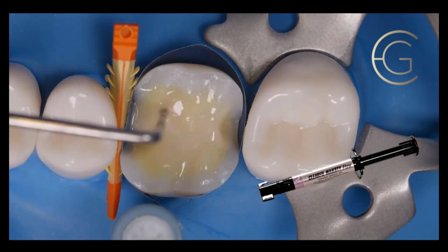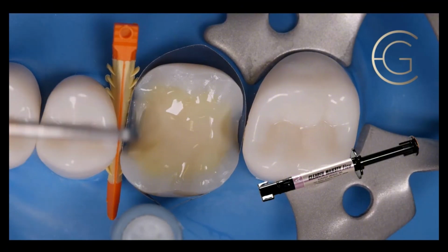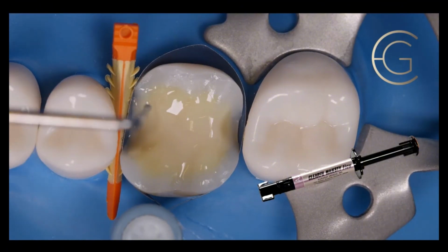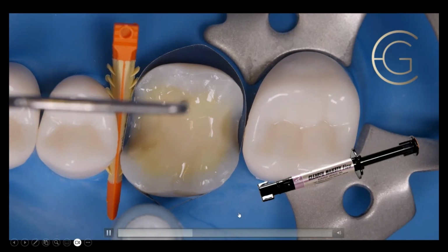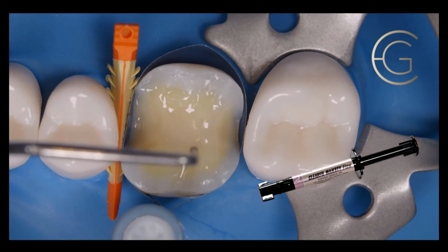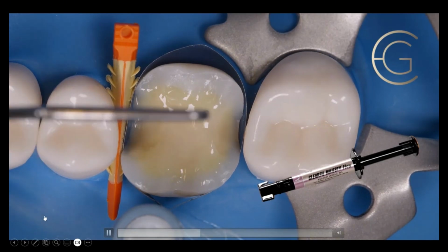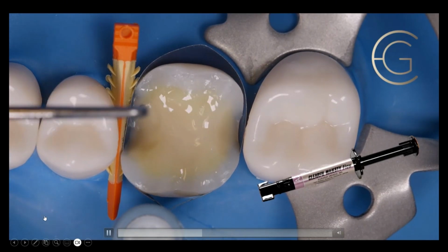Then once you've got it down, you're going to be like, okay, I got this. This is easy. Now look on the mesial. I'm going down all the way to the margin. You can actually have your margin in resin. You're like, oh, this country's going to take my license away if I do that. There are so many studies, like 15 years, showing that you can. So if this is really deep, I'm going to actually build this up. It's kinder to the tissue to have that margin elevation.